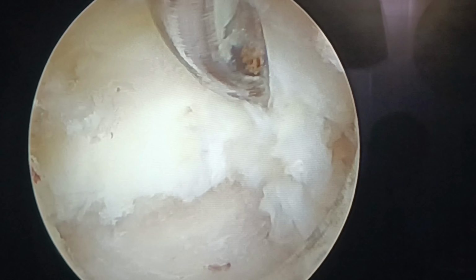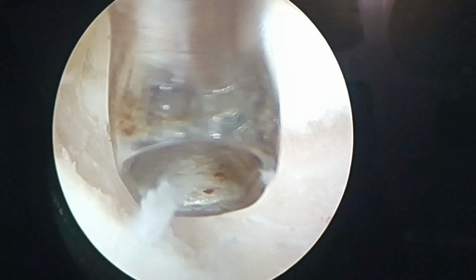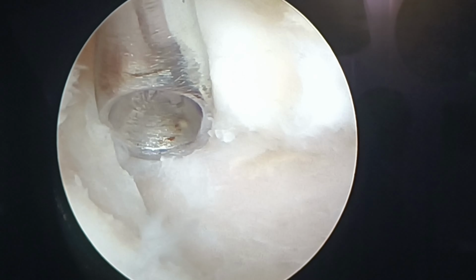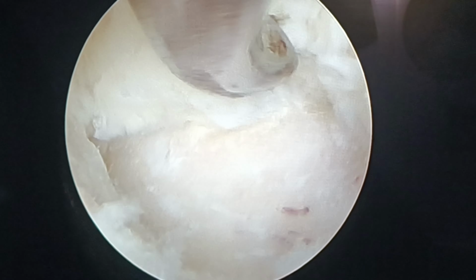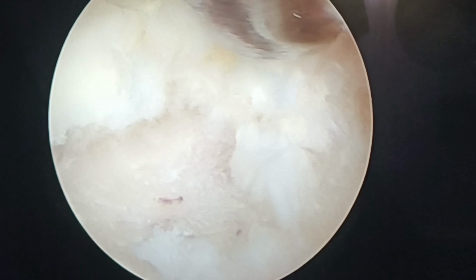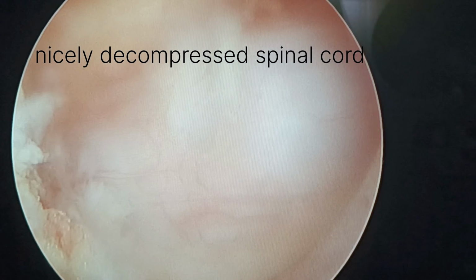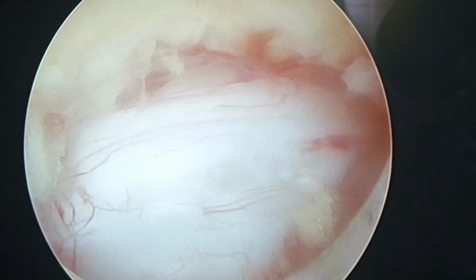Now I am using a curette to detach the ligamentum flavum attachment from the inferior lamina and the SAP. This is the inferior laminar detachment, and this is SAP, which I had drilled more, but for the sake of shortening, I had just cut it down. So afterwards I had removed the ligament in one piece.